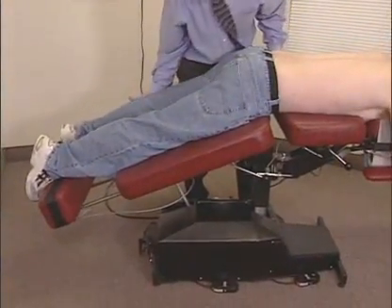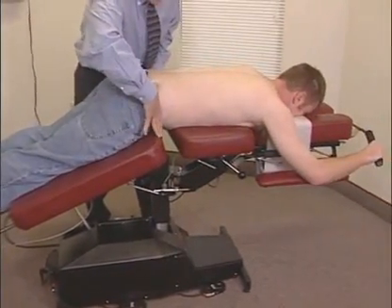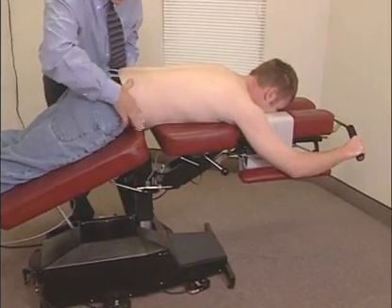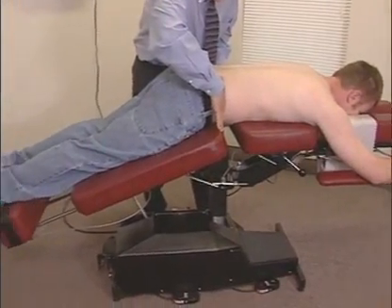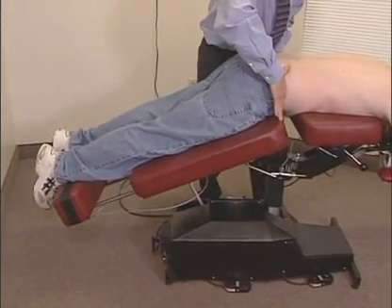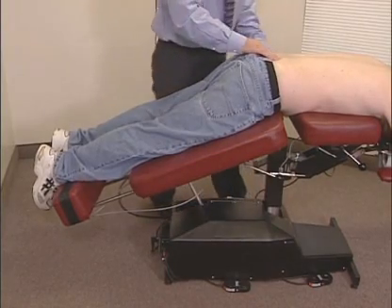When the table is in this position, it is easy for the patient to mount or dismount the table without aggravating the condition. When treating an L5 disc herniation, have the patient mount the table with the top of the sacrum at the top edge of the pelvic section. If this patient were to have an L4 disc herniation, position the patient so that the top of the L5 vertebra is at the top edge of the pelvic section.